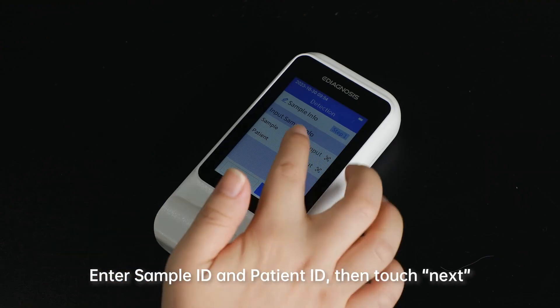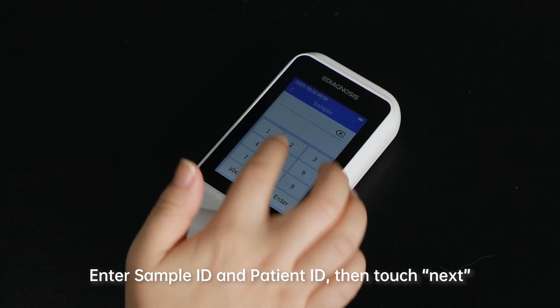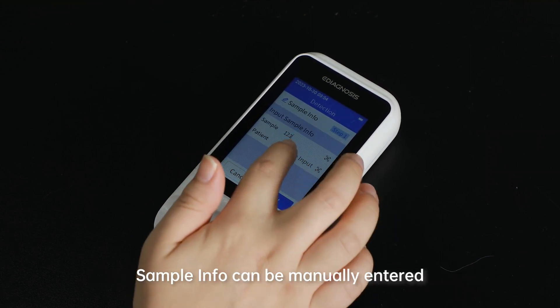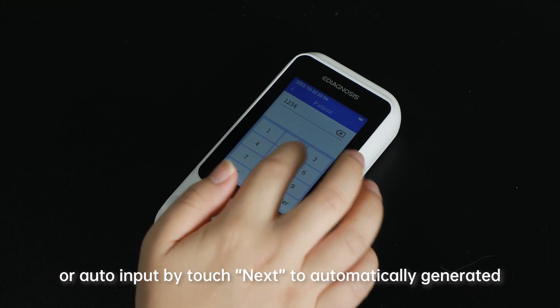Step 3: Enter Sample Info. Enter the Sample ID and Patient ID, then touch Next. Sample info can be manually entered or auto-input by touching Next to automatically generate it.